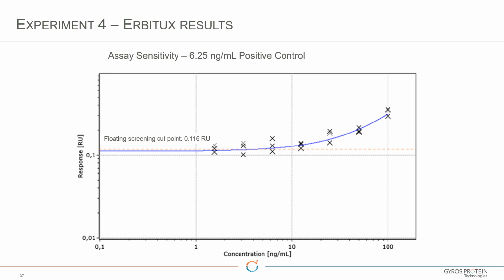And now for the results of the assay sensitivity. So we take the positive control and we serially dilute it. And we're looking at the level where the positive control sample goes below the cut point. It's probably the best way of doing sensitivity, to be honest. Some people will try and do response curves to actually interpolate the sensitivity level, but just finding the first concentration that remains above the cut point is probably the easiest way of handling this data.